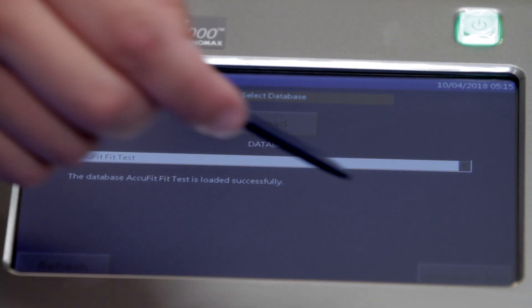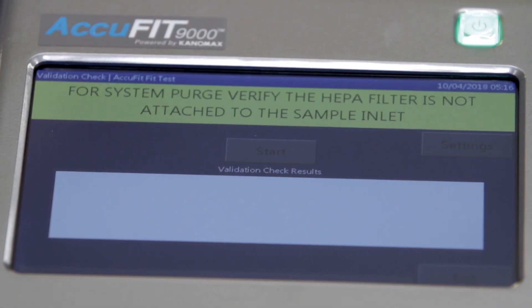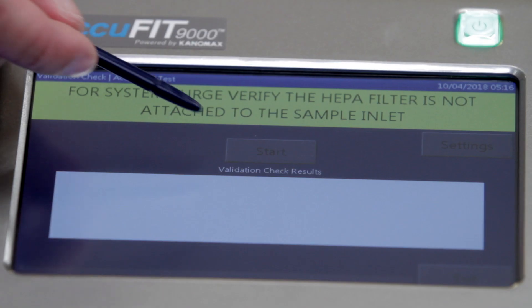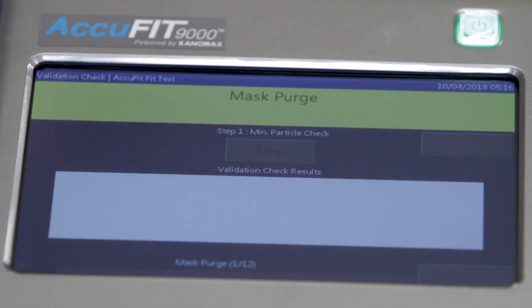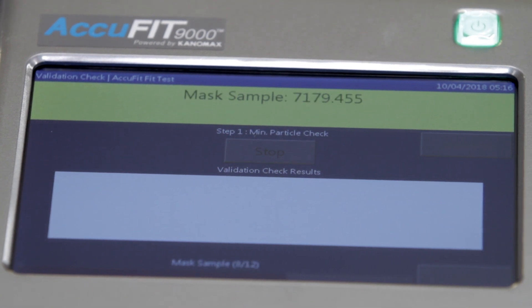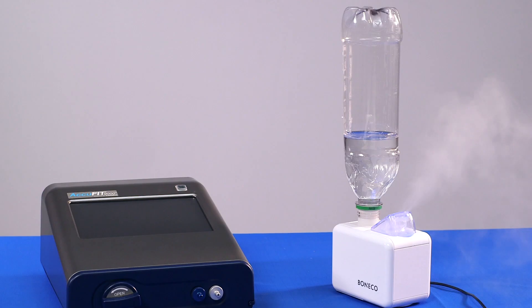Once the database has been successfully loaded, select Validation Check. Next, remove the HEPA filter from the sample line and tap Start to begin the validation check to verify that the particle concentration in the ambient air is high enough to perform a fit test. An ambient count of 1,000 particles per cubic centimeter or more is required to perform this test. A particle generator is available as an accessory for environments that contain less than this amount.